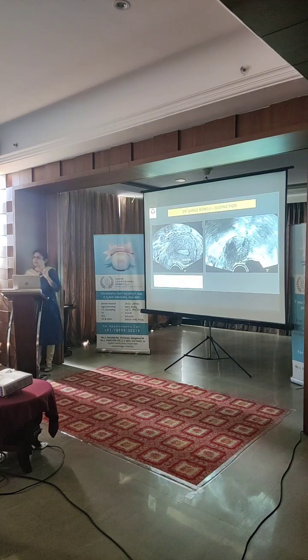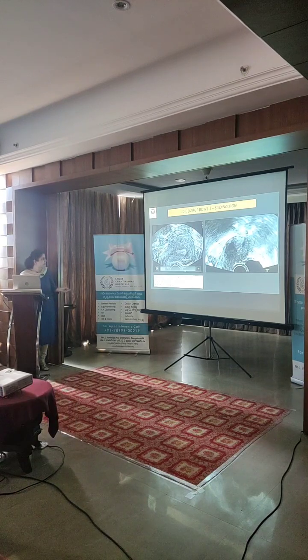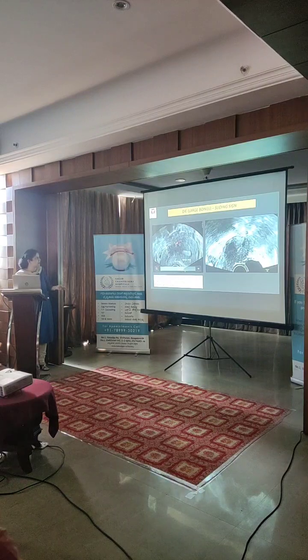Now, in every single patient, whether she's got endometriosis or not, we have to look for the sliding sign. When you see a report from our department, it always has a sliding sign. We see whether there's a high sliding sign and a low sliding sign. And basically the sliding sign is sliding of the bowel behind the uterus. So you can see it's smoothly sliding, there's nothing stuck. So in this patient, I know the sliding sign is present.